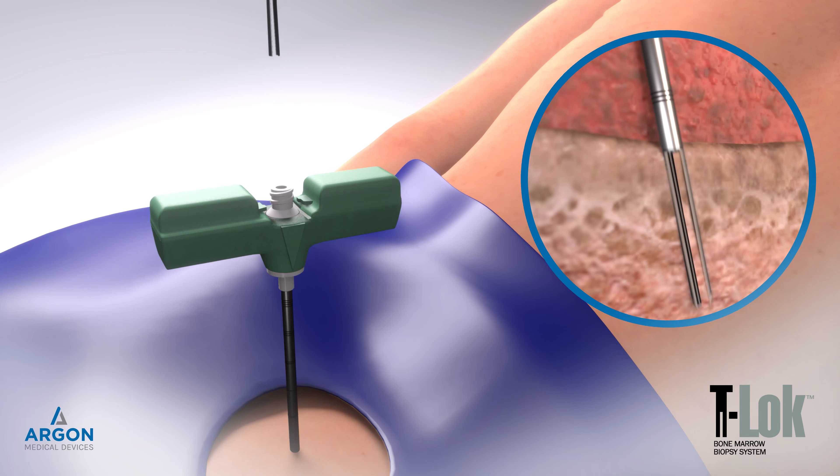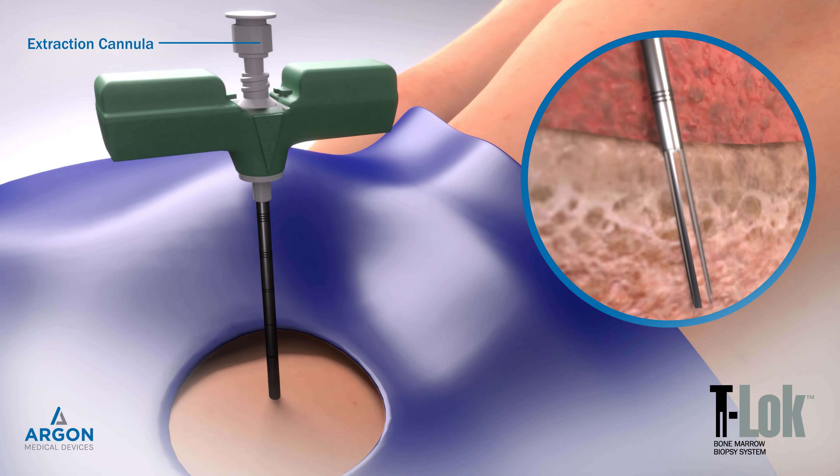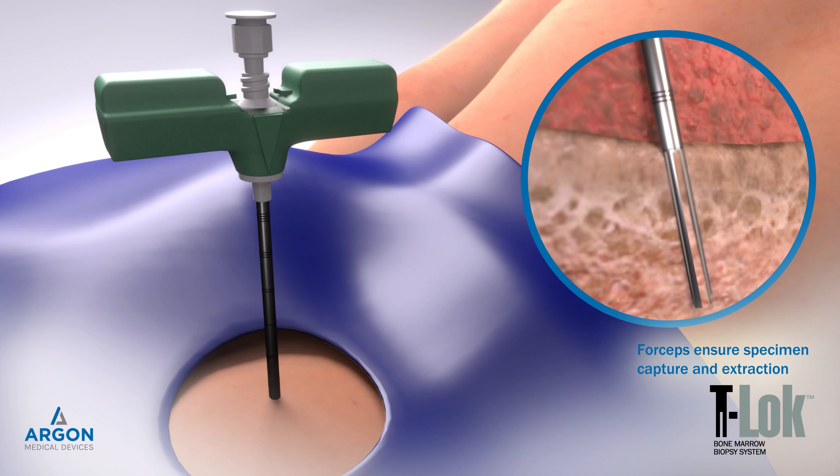Insert the T-Lok extraction cannula fully into the needle cannula. Do not rotate the T-Lok extraction cannula within the needle cannula. The T-Lok extraction cannula traps the bone marrow sample inside the needle cannula for positive extraction, eliminating the need for a painful deflection technique to separate the specimen.